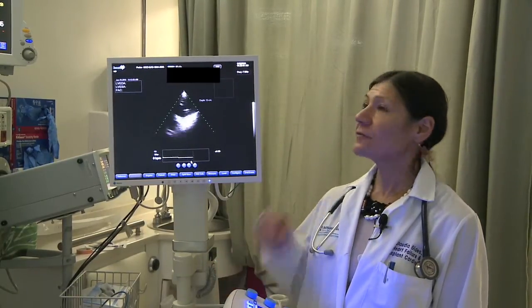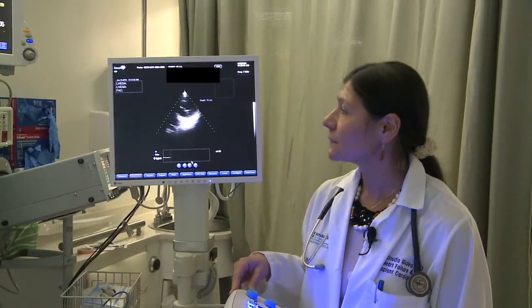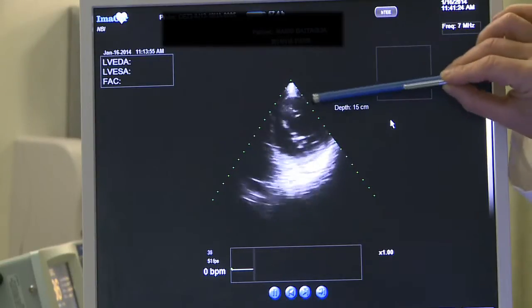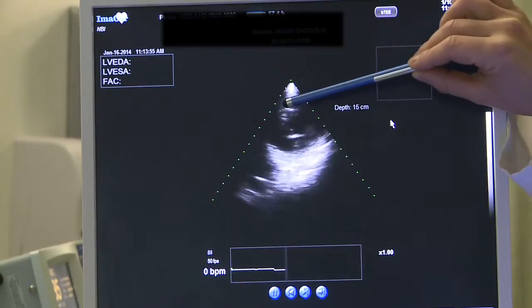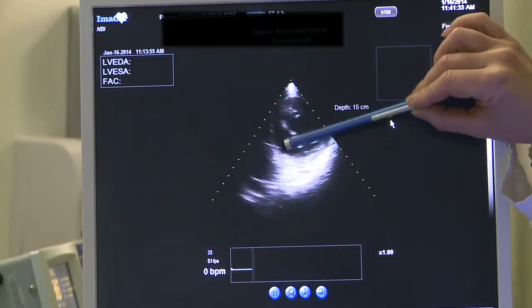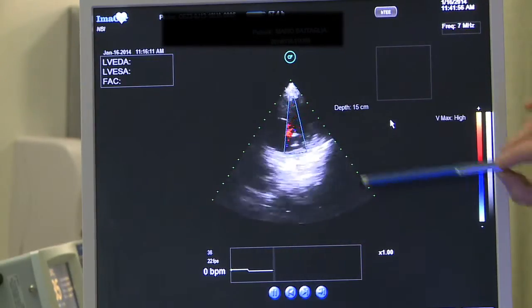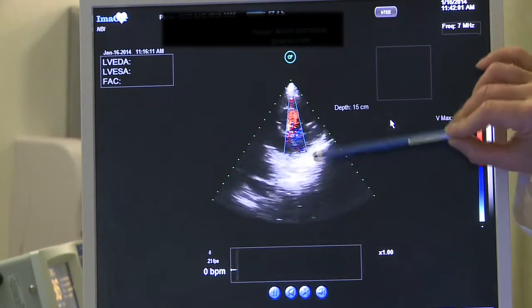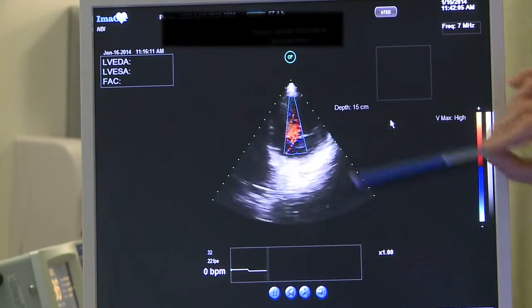We have a CVP of 12 and mean arterial pressure of 77. The Imacor probe is placed in the stomach. We are viewing the short axis of the left ventricular cavity, the mitral valve, and the inflow cannula of the LVAD. We do have the interventricular septum and part of the RV visible. We place color over the inflow cannula and we see very nice laminar flow — there is no turbulent flow, which means the cannula is functioning well.